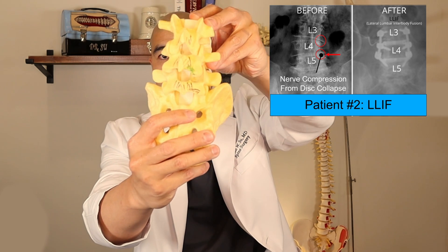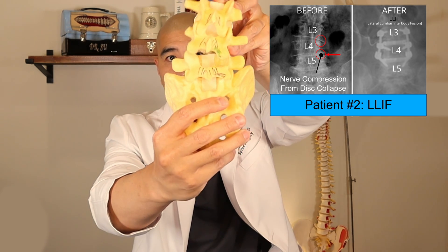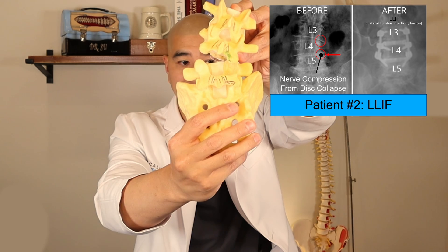Here's another patient with scoliosis causing biomechanical compression at L3-4 and L4-L5. We did a lateral lumbar fusion — an LLIF — and post-operatively you can see we straightened both levels, corrected that deformity, and opened up the space for the nerve. In the back, we again placed minimally invasive pedicle screws.